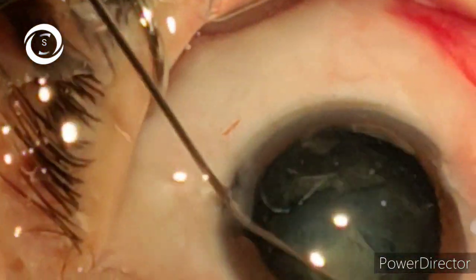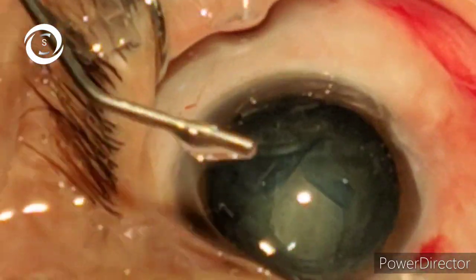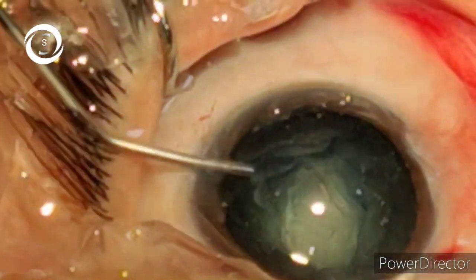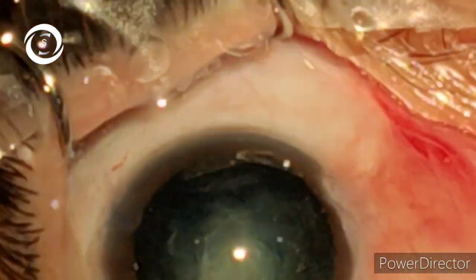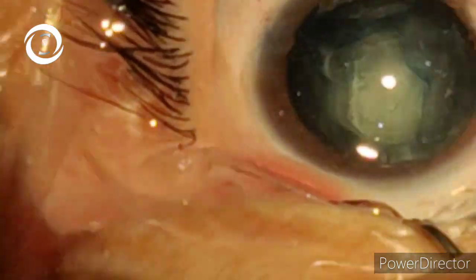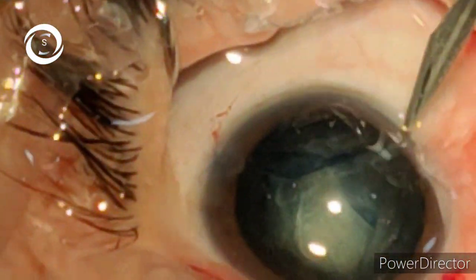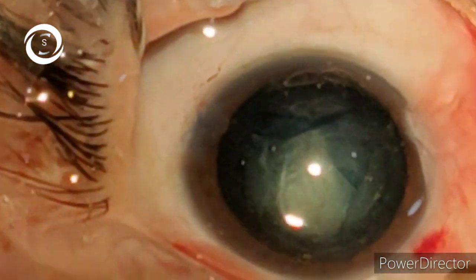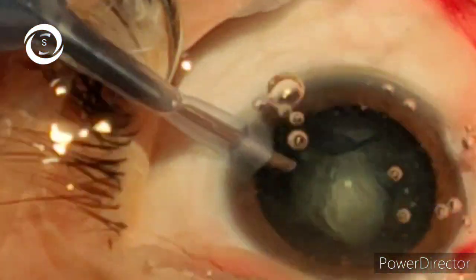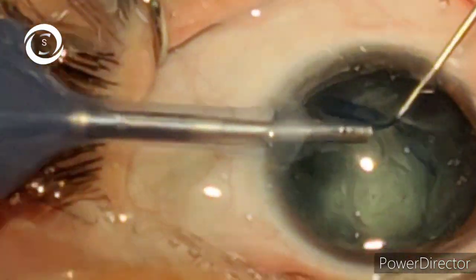For efficient nuclear division, make sure you have a round, regular rhexis with smooth edges and perform adequate hydrodissection — as extensive as possible. In early stages of learning you can even rotate the nucleus; I usually skip this step but for beginners it's best to perform.